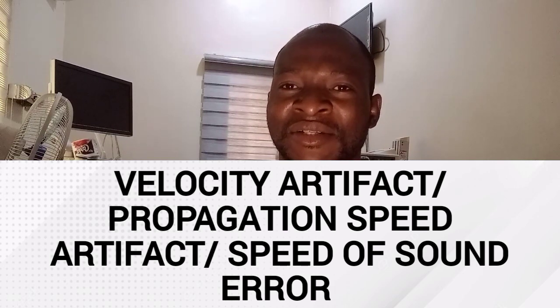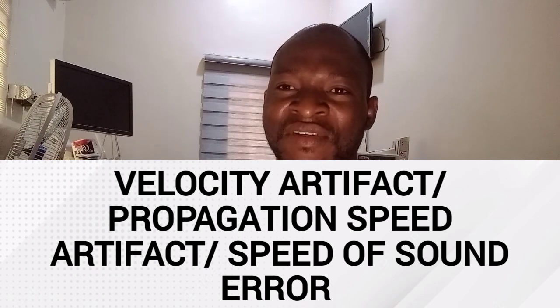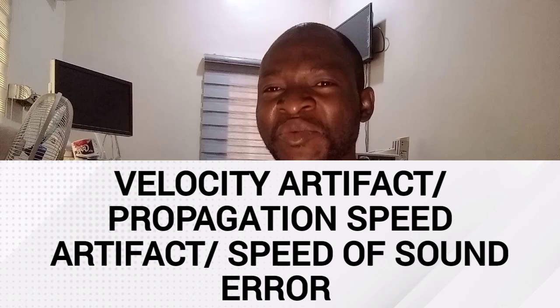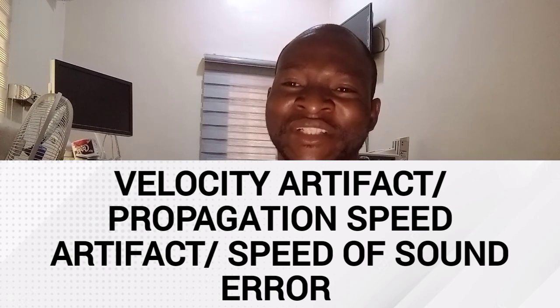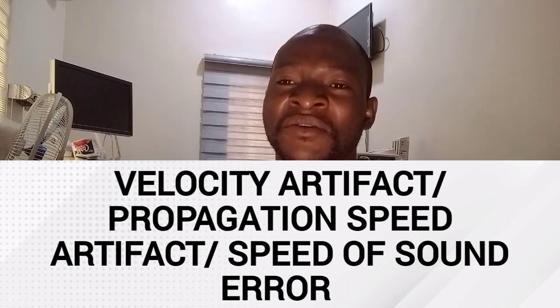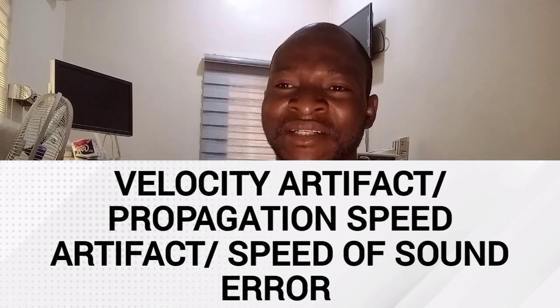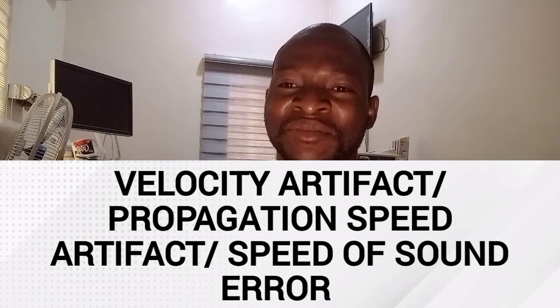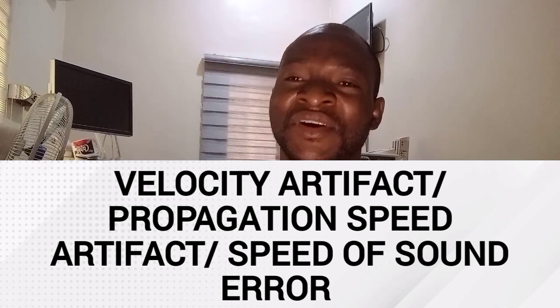Fat and fluid-filled structures are typical causes of these artifacts. But similarly, if the velocity in the medium is faster than in soft tissue, in other words greater than 1.54 millimeters per microsecond, all the go-return times will be shorter than they should be, with the result being that the echoes will be displayed closer to the transducer than they should be. In this case, metal has a higher speed of sound.